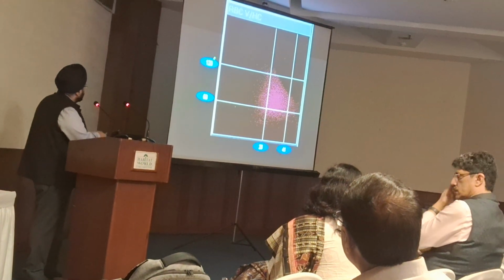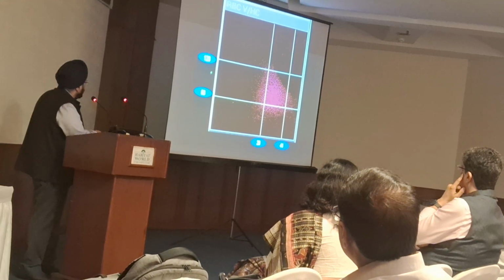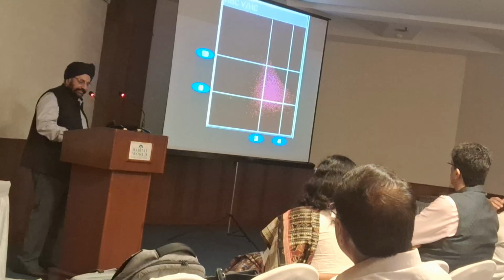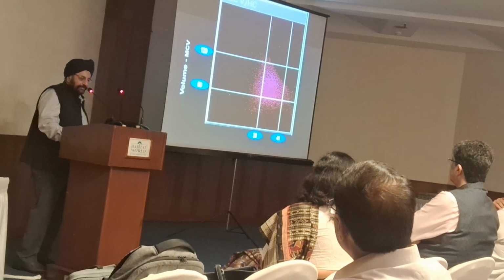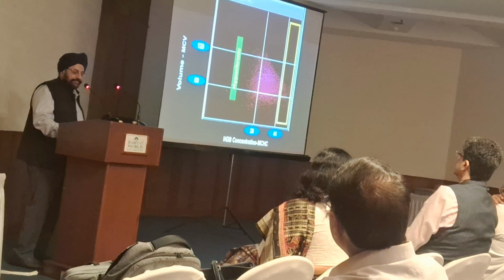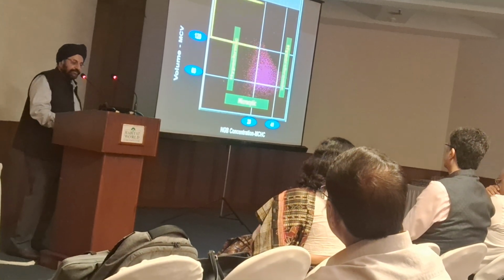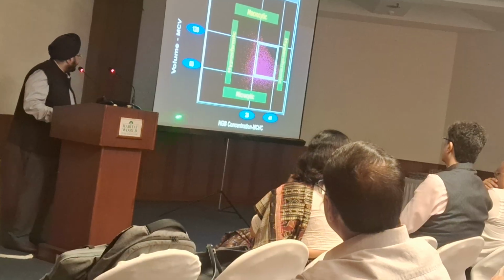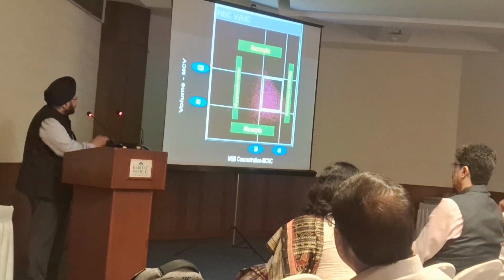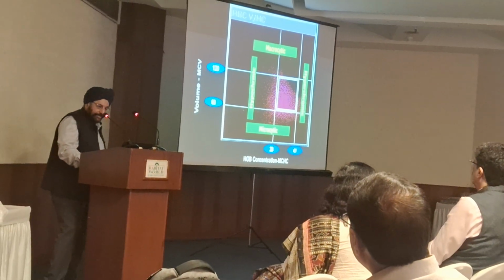On the y-axis is the MCV with two determinants at 60 and 120, and on the x-axis is the MCHC with two determinants at 28 and 41. It is obvious. This left area here is the area of hypochromia. This is hyperchromia. This is microcytosis. This is macrocytosis, and this middle square here is the area of the normocytic normochromic. Even without looking at any of the indices, just this scatter plot is going to give away what it is in most cases.